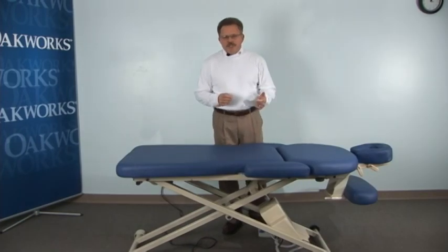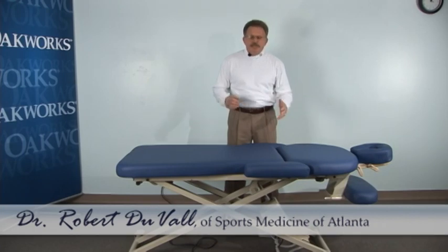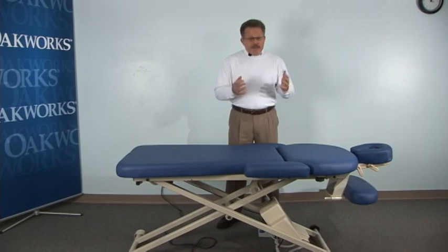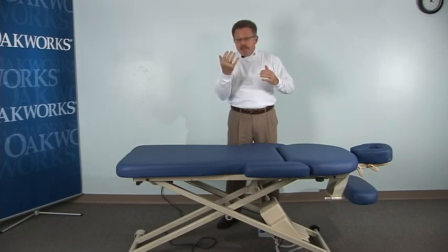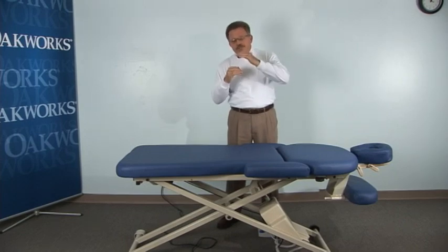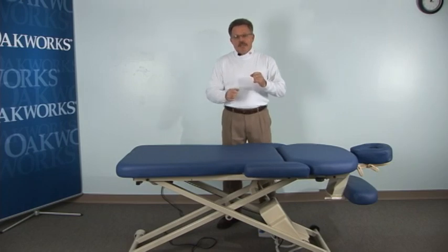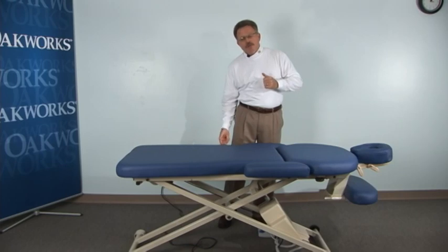Another awesome feature of this PT400M center break point is the ability to have the patient lie side lying. Many of our patients, as we see, have pelvic obliquities with a predictable compensatory concavity or convexity acquired in the C-spine, along with adaptive shortening of the muscles on usually the long lower extremity side. That would be elevation of the right hip, causing side bending to my right, shortening my quadratus lumborum.